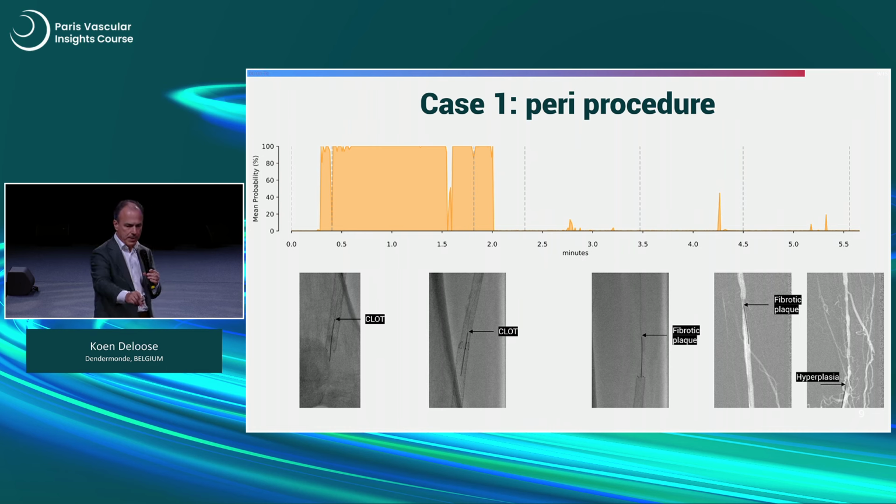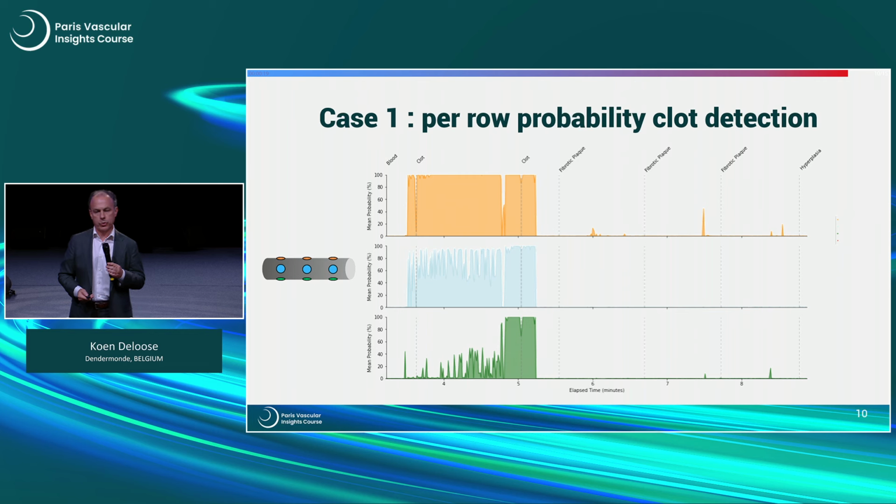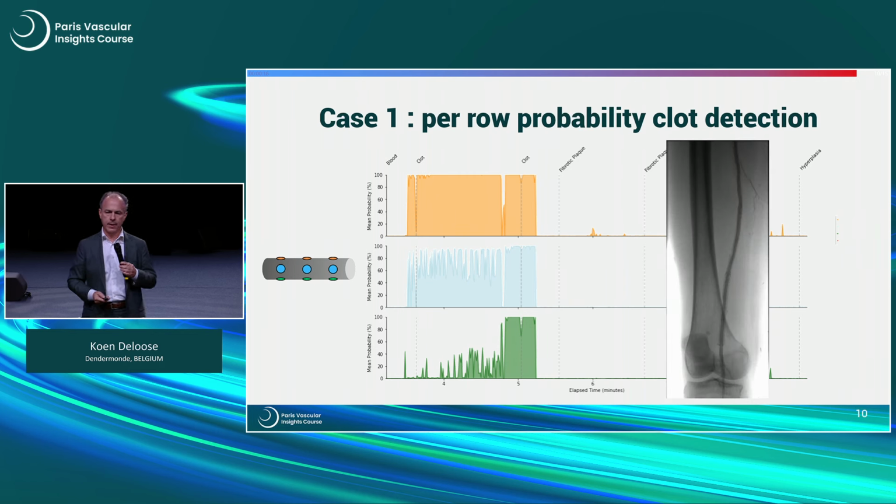As long as we were in the stent, you have a huge detection of clot material, fresh clot actually. From the moment I leave the stent, pulling back the device, you see that there is no detection anymore. So for me this was a clear proof and confirmation of what I thought I was confronted with, and that I also did the right treatment.